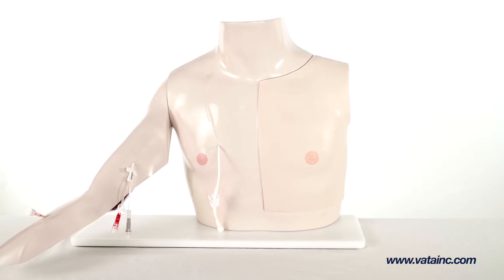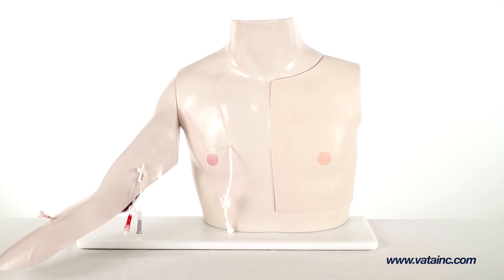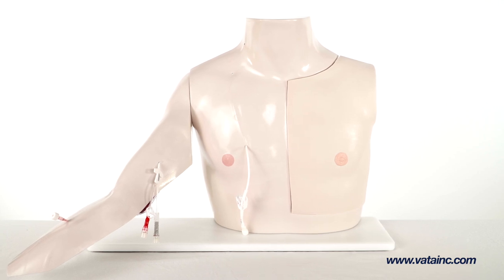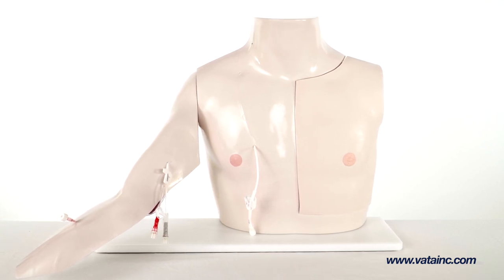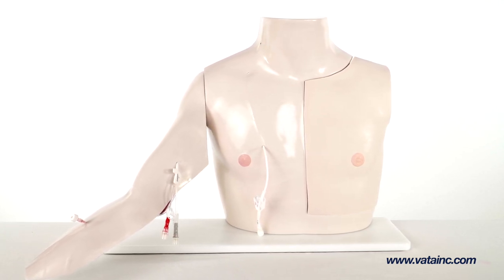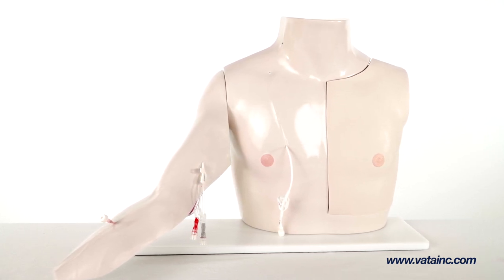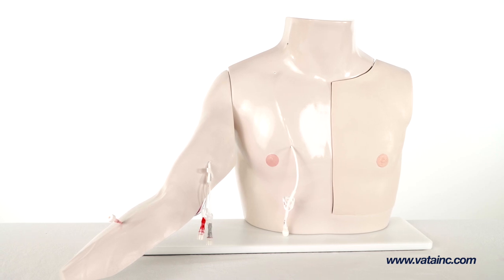One of Chester Chest's best qualities is that it lasts. Vata offers a refurbishing service to restore your Chester Chest to a like-new condition at a significantly reduced rate compared to a new model. Customers can send in their old Chester Chest models and have them cleaned, updated, and refurbished.